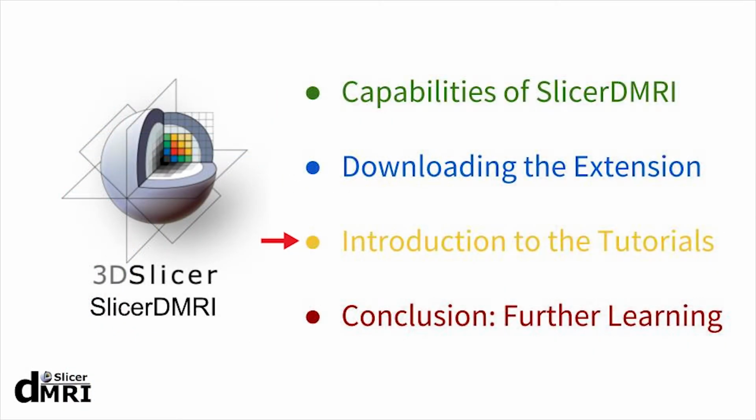Next, we will talk about each of the tutorials that connect with Slicer DMRI. They can all be found on dmri.slicer.org. We will summarize what you can learn from each tutorial. If one interests you, please head to our website where you can find these tutorials and many other resources where you can learn more about Slicer and Slicer DMRI.